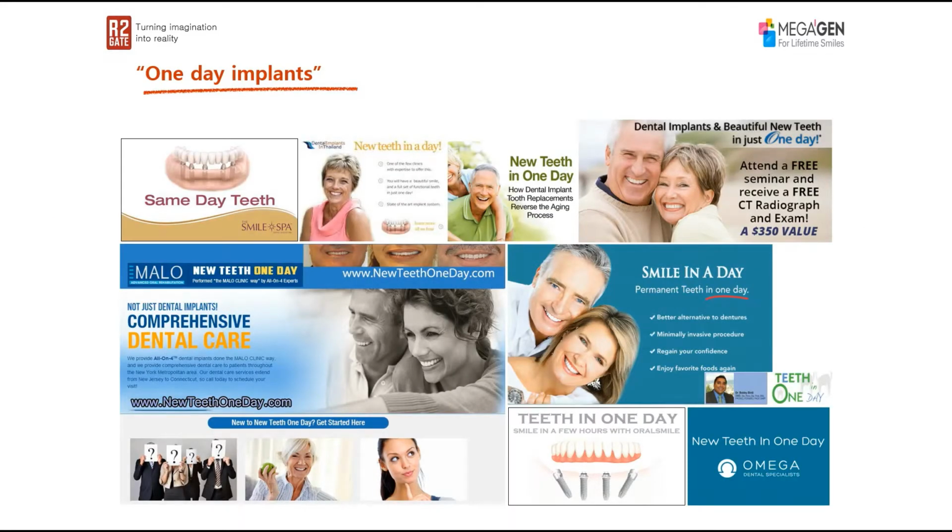So many people have been doing the one-day implants concept. We just call it in different names. Some people call it same-day teeth, new teeth in a day, new teeth in one day. These are just different names to essentially the same thing, which is, my patients come to the office and in the same day, they just receive a new set of teeth.